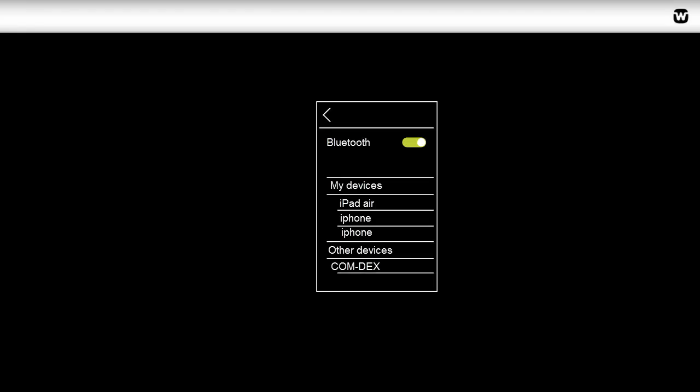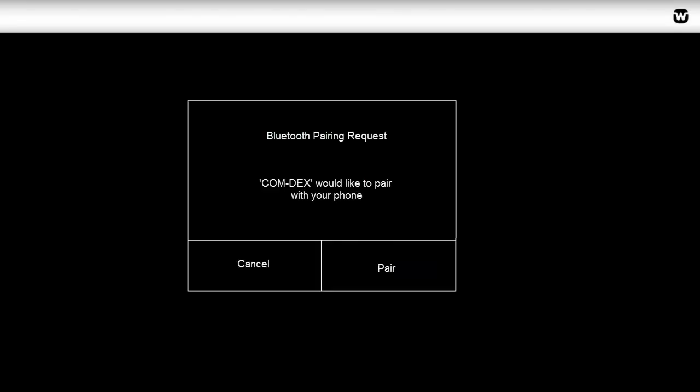Now make sure that Bluetooth is activated on the phone. If it is not activated, follow these steps or refer to the phone's user guide.